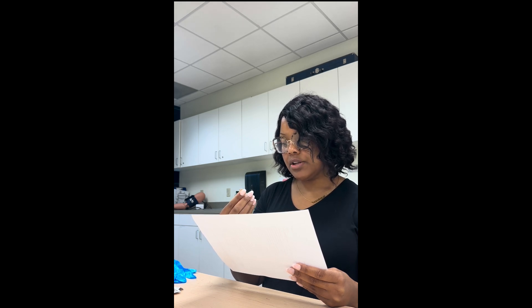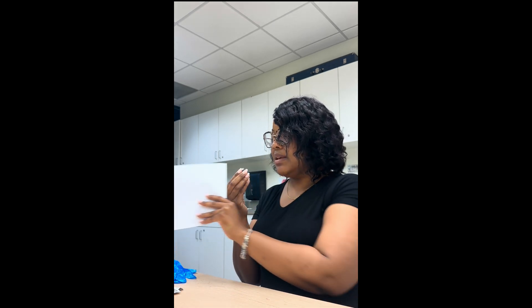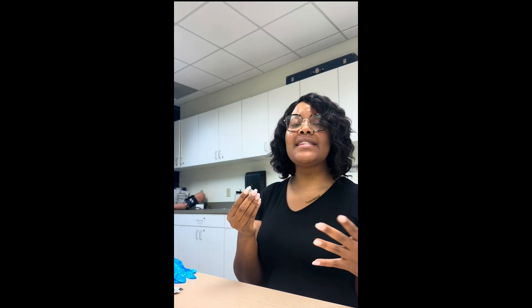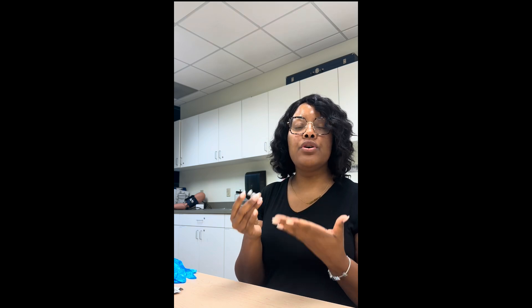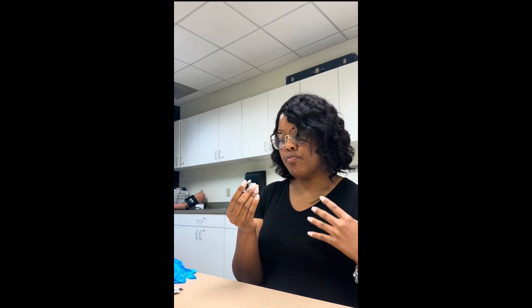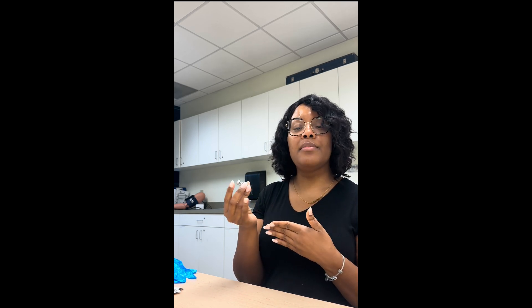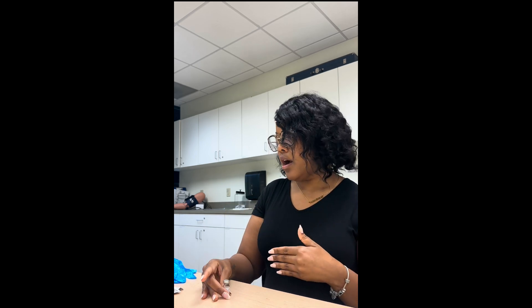I'm checking to make sure I have everything I need. One thing about TB tests is that you do share a multi-use vial — you will share this with your floor, so there is more than one dose in here.